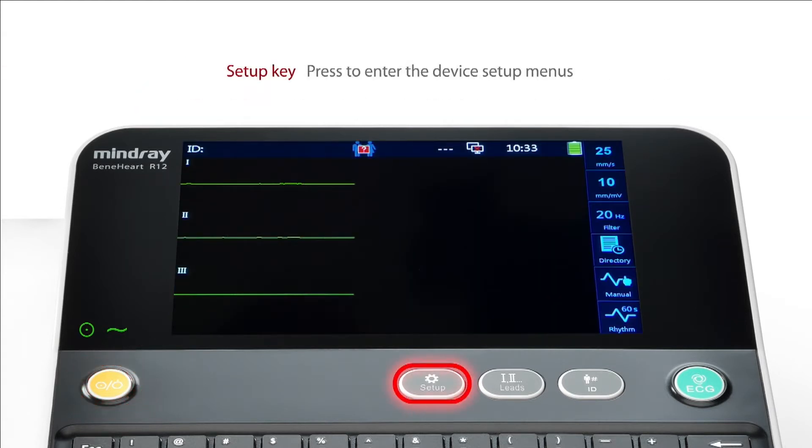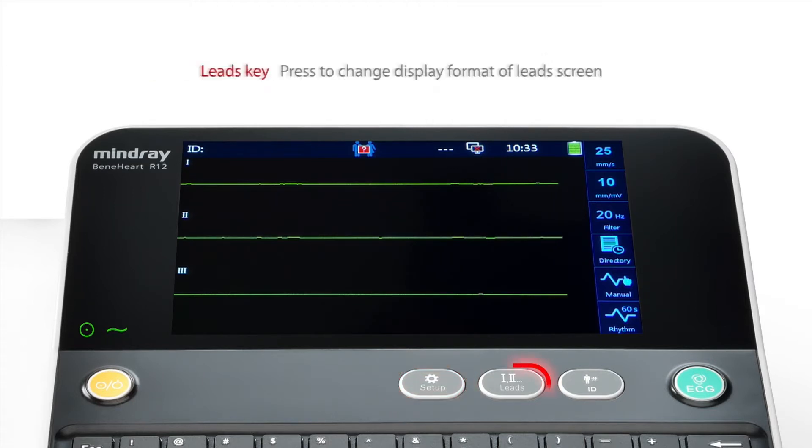The setup key is used to enter the device's setup menus. The leads key is used to change the display format of the lead screen. The ID key is used to enter the patient information menus. The ECG key is used to start the acquisition of an ECG report.